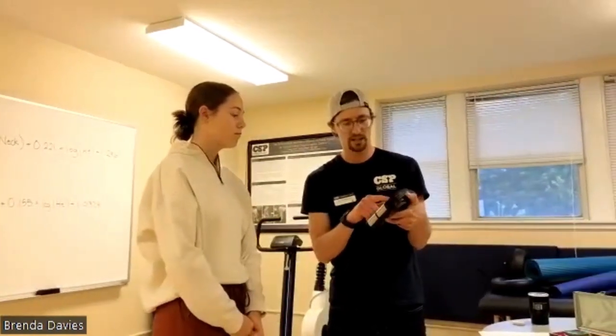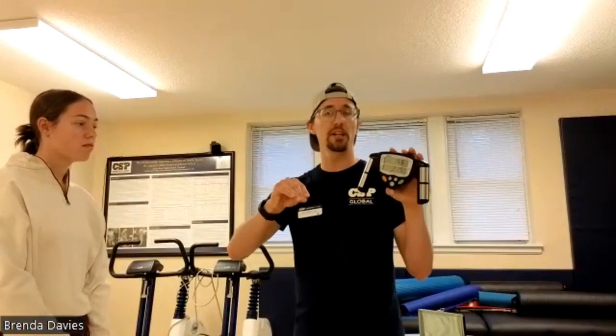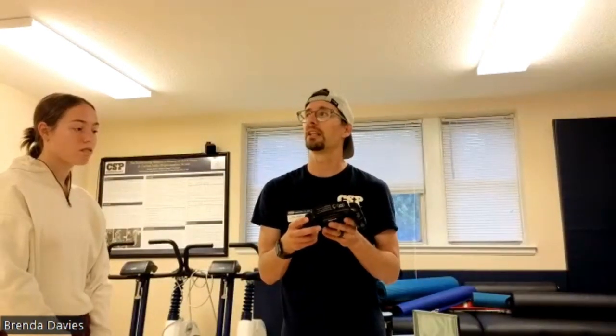Okay, perfect. So the normal classification that you had was 16.6% body fat. You should probably write down the one that you had here. I think it was 13.3 is what I saw from the bod pod. So bod pod was 13.3%. We got 16.6% as the normal classification for the individual with BIA, with a BMI of 21.5.